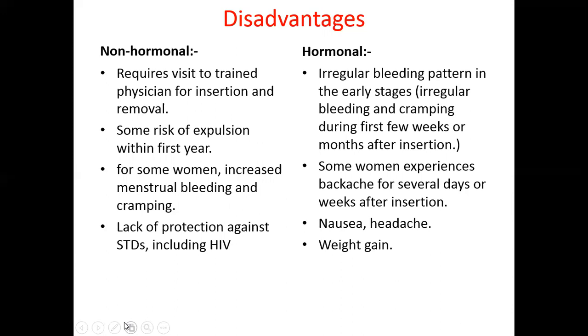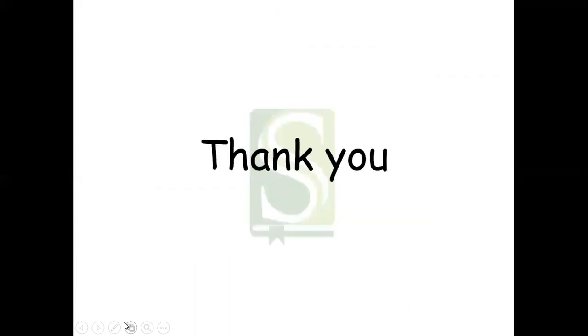The disadvantages of hormonal IUDs are that there is an irregular bleeding pattern in the early stages. Some women experience backache for several days or weeks after insertion. Also, some women experience nausea and headache, and also there is a major problem of weight gain. So this was all about intrauterine devices.